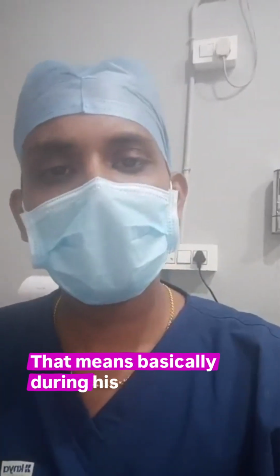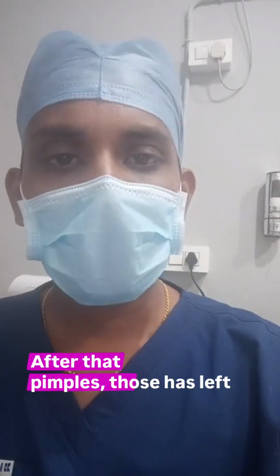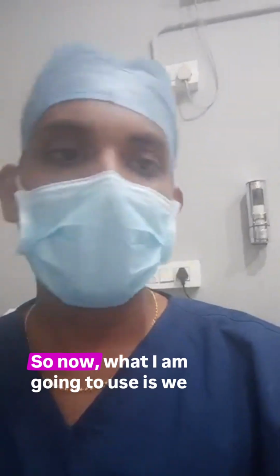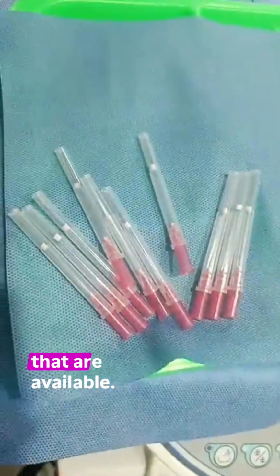Basically, he is around 28 years old now, and during his teenage he had huge pimples over that area. After those pimples, they left scars on his face that have led to the deep pores, right? So now what we are going to do is insert PDO threads. See over here, these are the various PDO threads that are available.